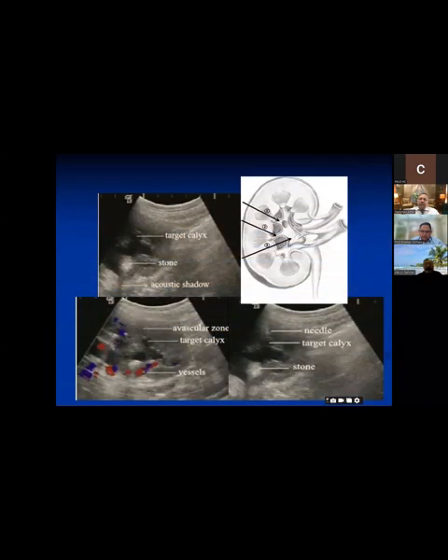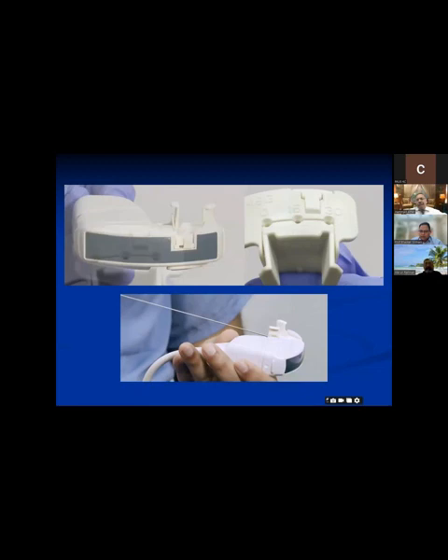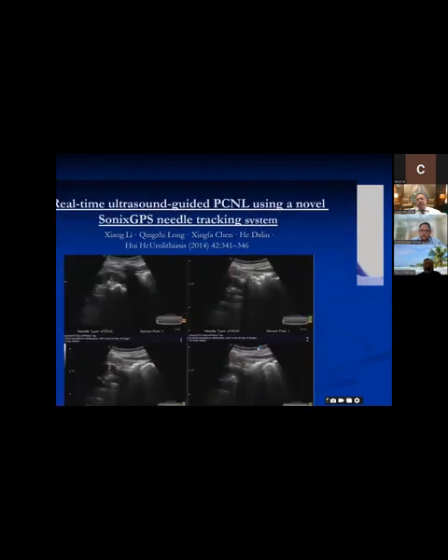Again, using the help of Dopplers, one can avoid the bigger vessels and certainly decrease the hemorrhage. And if you want to target this area, this is important. And this is the pyramid, as we all know, to avoid that. And these are the different probes, and where you can pass the needle, and it guides you. So again, it is one of the tools available.